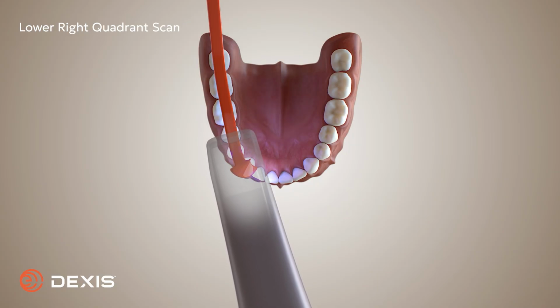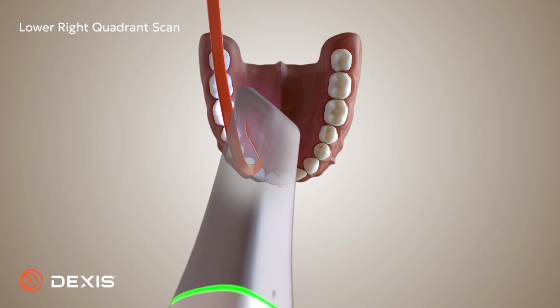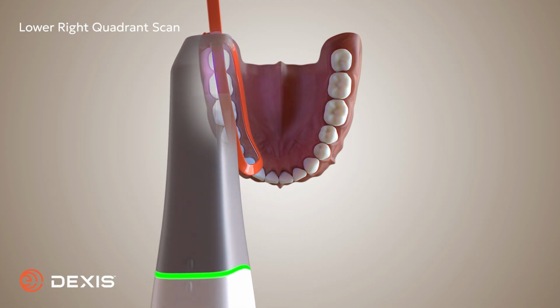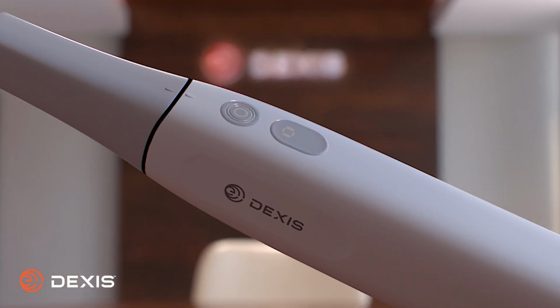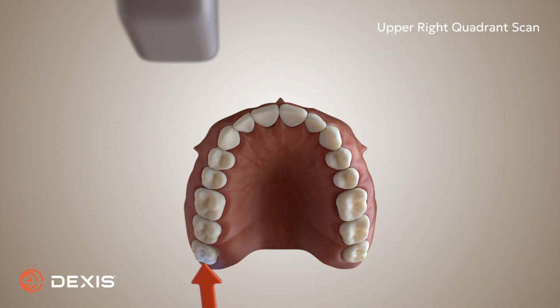At the canine, rotate the scanner 45 degrees toward the lingual and scan from canine back to molar, keeping light contact along the lingual surfaces. Next, glide the scanner over the occlusal surface and angle 45 degrees toward the buccal, scanning from molar to canine. Press the mode button to select the opposing arch and repeat this same recommended scanning path.